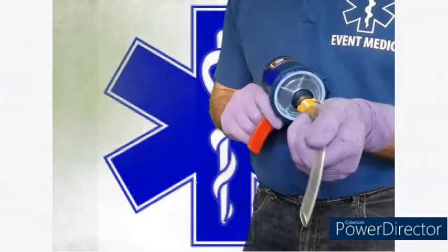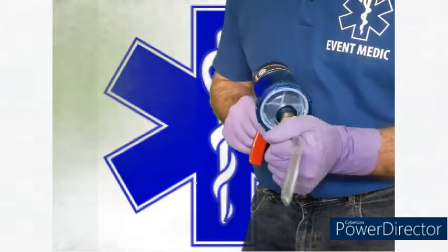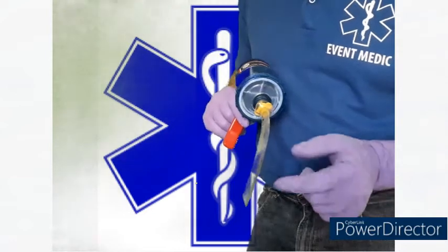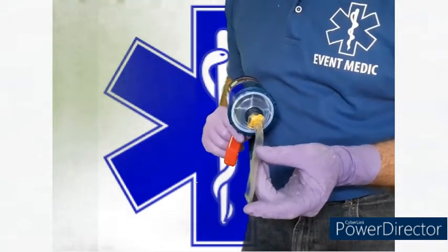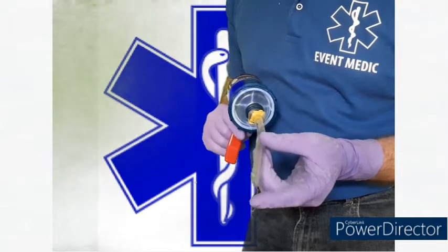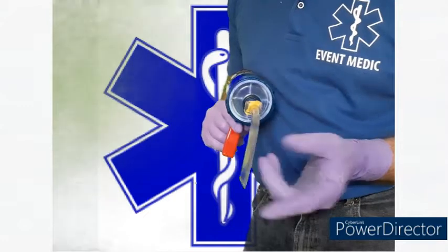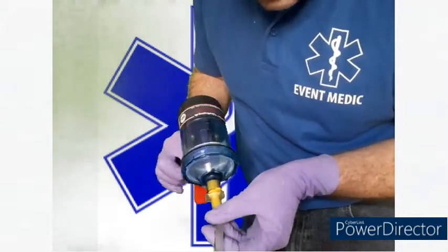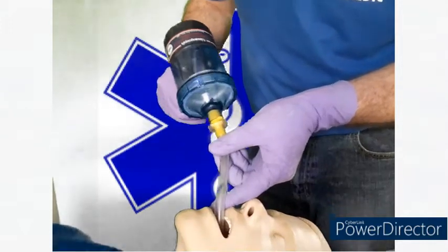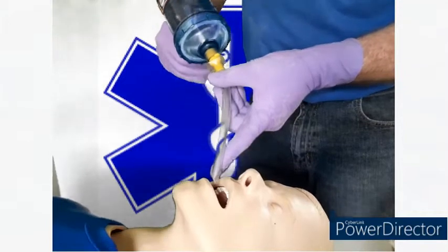And all I'm doing is using it as a catheter to go in. Now again, in the past we would have done other methods of this, but the most current way that we teach is you only put the tip in as far as you can see. So you're making sure you've always got visual sight of the actual tip of your catheter. So no need to measure, because when we go in we can still see the tip, and then we can suck only on the way out for a maximum of 15 seconds.